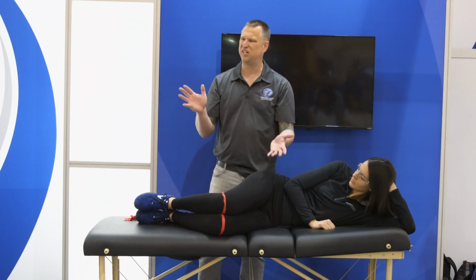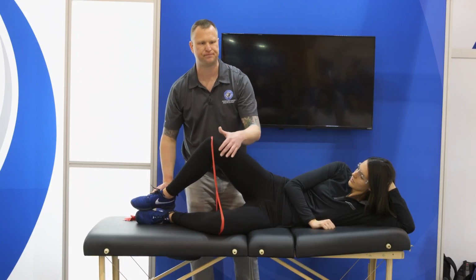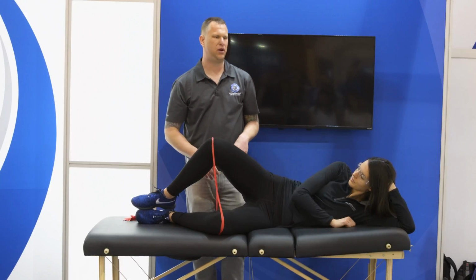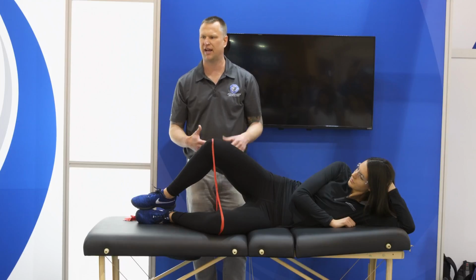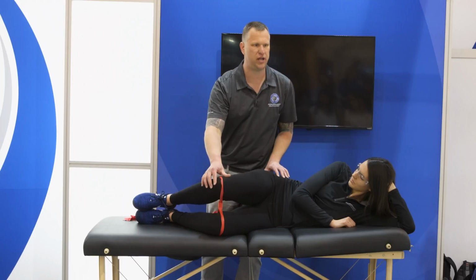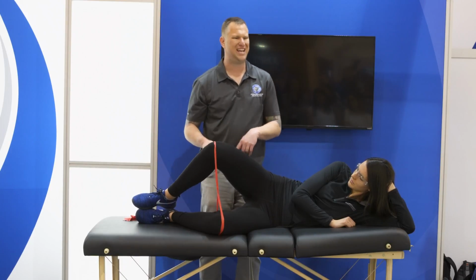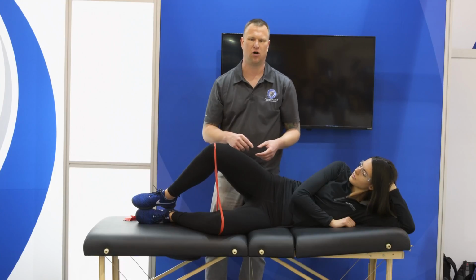Well, I can progress from what we just did, concentrics, to an eccentric protocol. So I could have her come up and hold that. Again, just holding for a period of time, your discretion, 5-10 seconds, and then work on that slow unwinding. Again, very elementary kind of PT 101 exercises for right now, but I want you to consider, again, ease for the patient, the thought process at home.